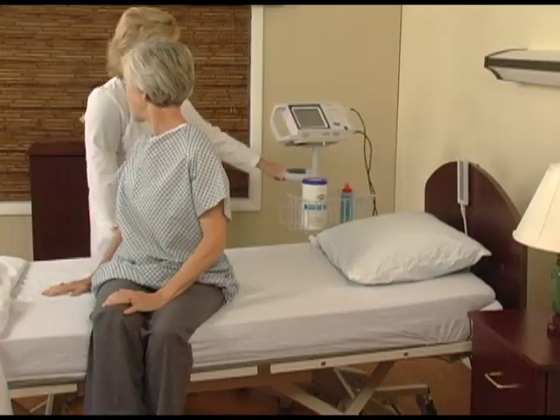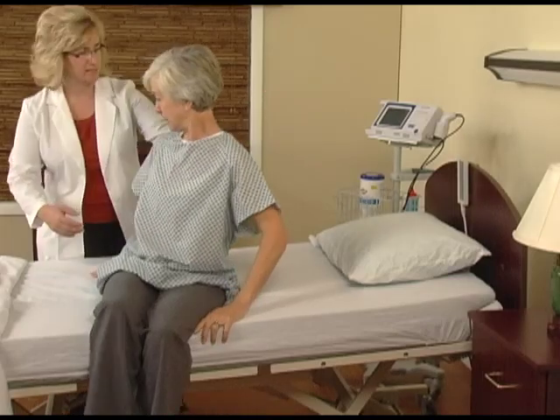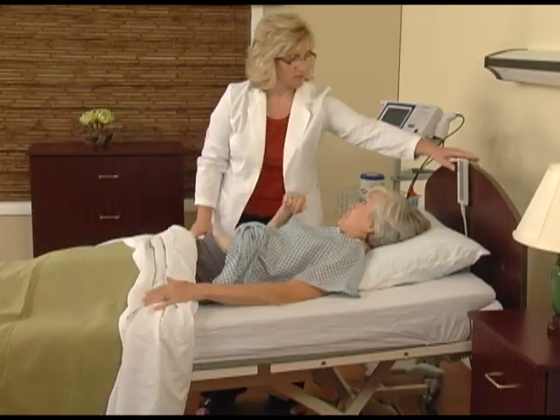To help obtain better results when scanning, you should first assist the resident into a comfortable position, lying down with the head slightly elevated. Avoid elevating the feet. This helps position the bladder for the scan.